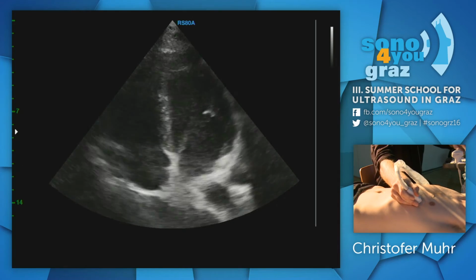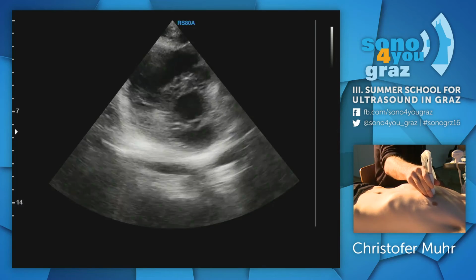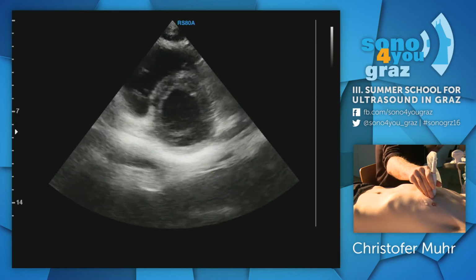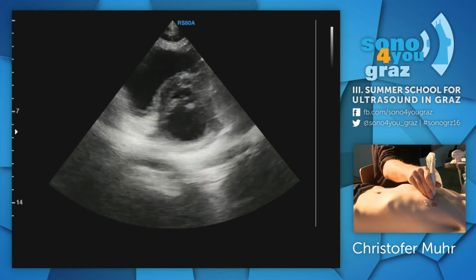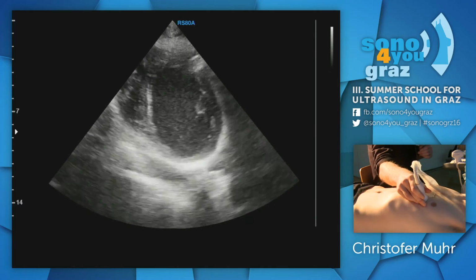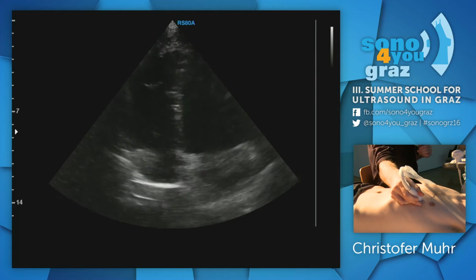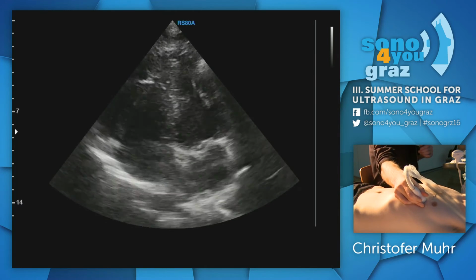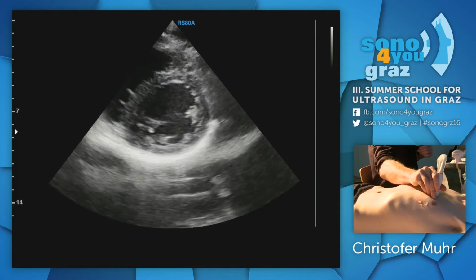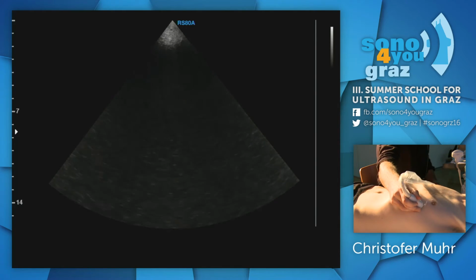All right. Now we go, just one last thing. So if we have a nice parasternal short axis like this, one of the tricks you can do is actually to slide in that intercostal space towards the apex, okay? So you just slide, slide, slide, you have it in the view, and then just tilt it, okay? And then at least you know you're around the right site. Did you see what I'm doing? So you just follow, you see the heart all the time, and just slide down there.